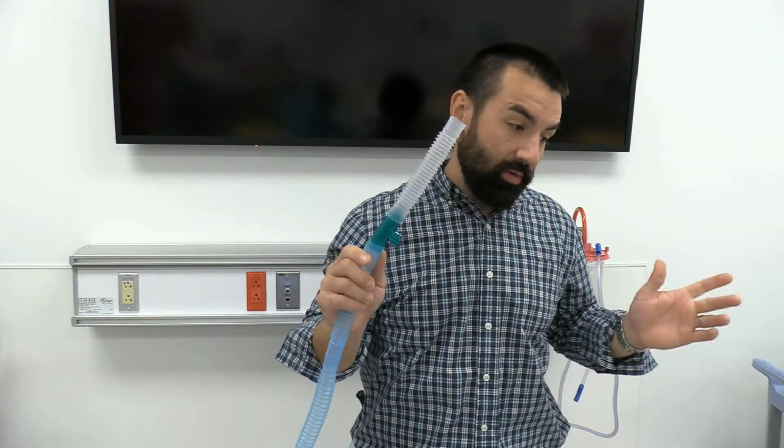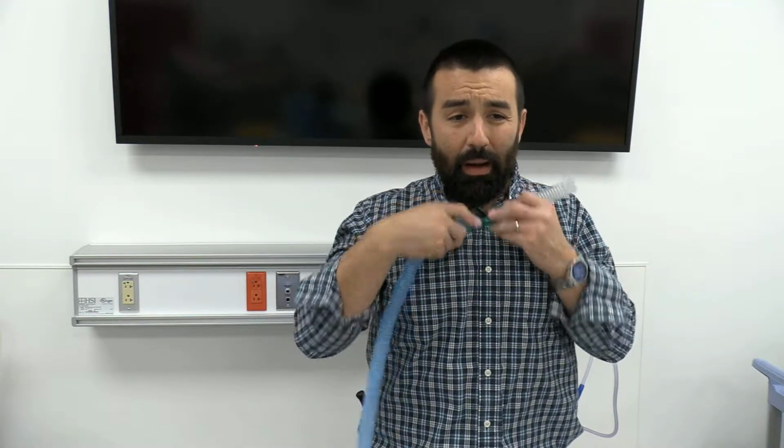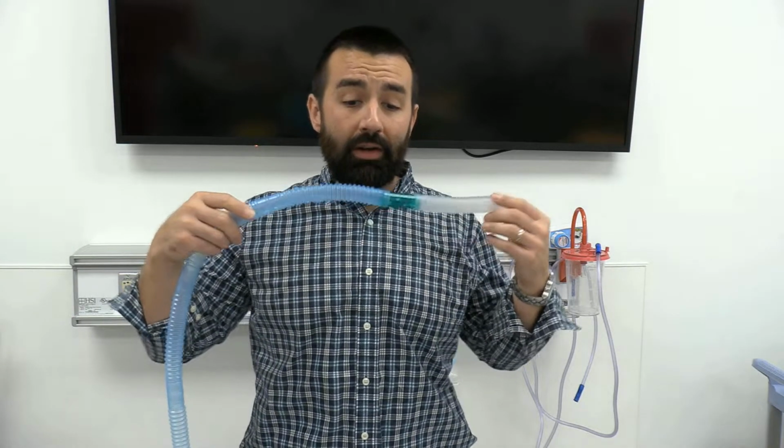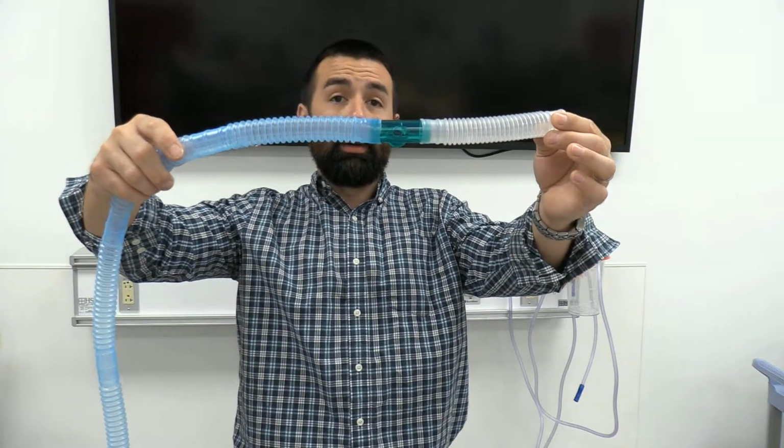Now the problem with Briggs adapters, besides that we don't commonly use them, is I still have to pop a patient off to suction them, and then they're not getting any oxygen. Anybody with an artificial airway, we're going to have to suction them or check or pass something on the tracheostomy tube or ET tube at some point. The other problem is if you have somebody with a really good strong cough that's clearing all their own secretions, if you're not monitoring these patients, you can actually fill that tubing up with secretions.